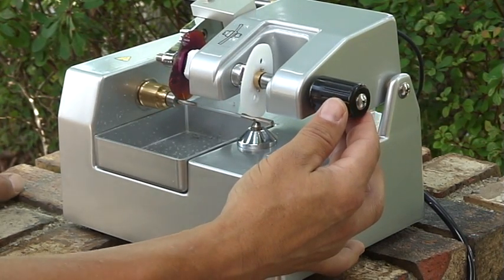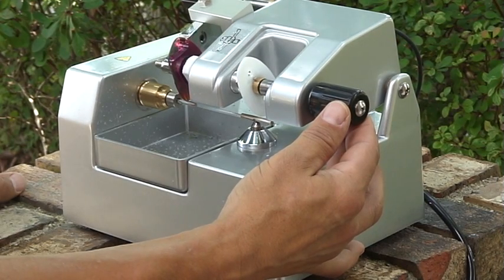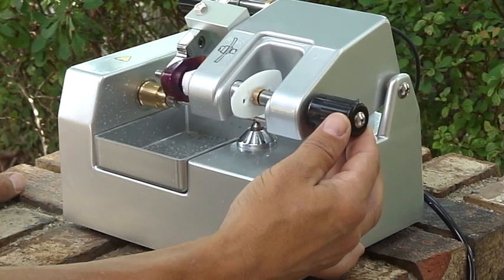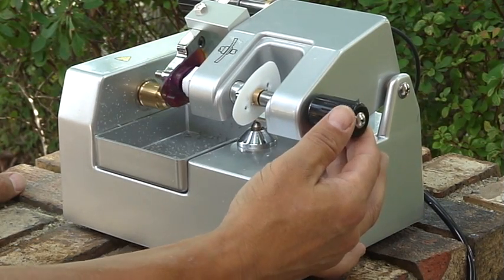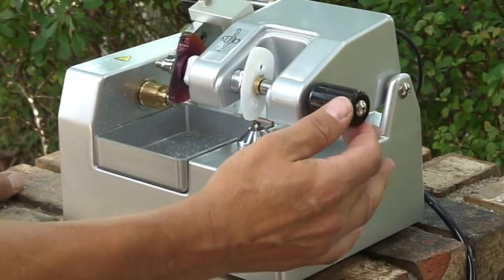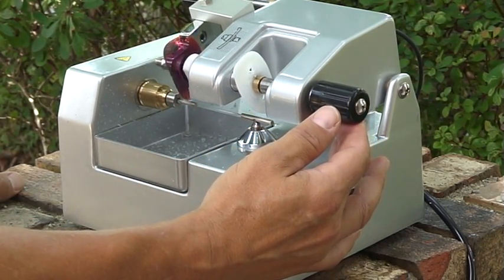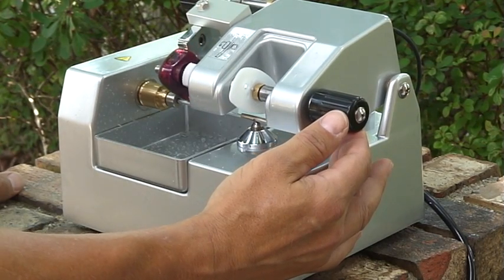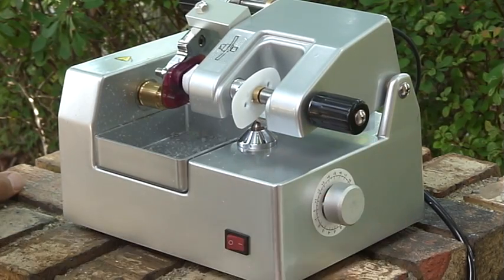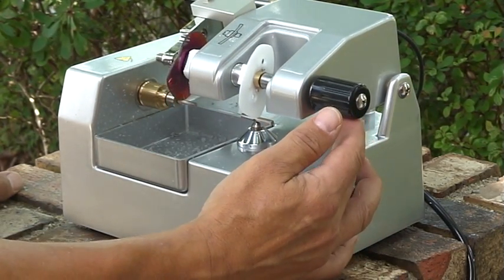Again, I don't want it to take too much at one time, because it'll bite and it'll cause the lens to flex in the mount. So the first couple rotations I'll support it so that it won't bite too hard. Couple more rotations should have it.